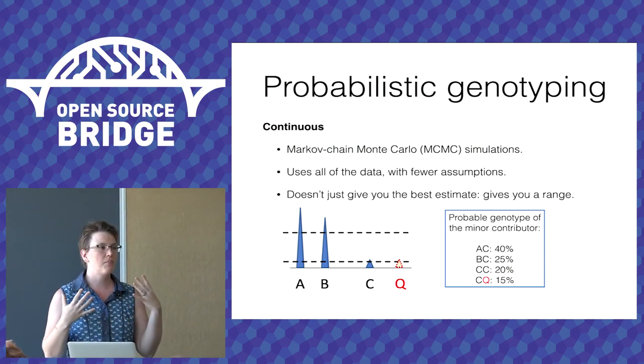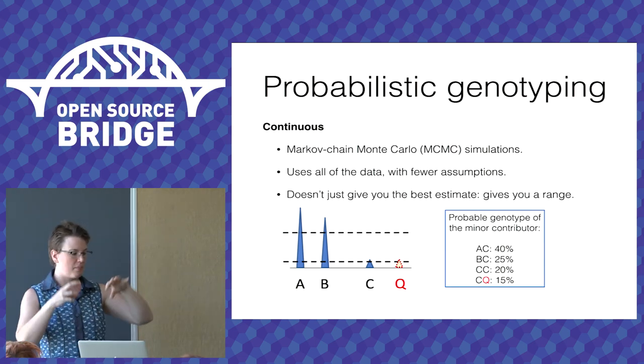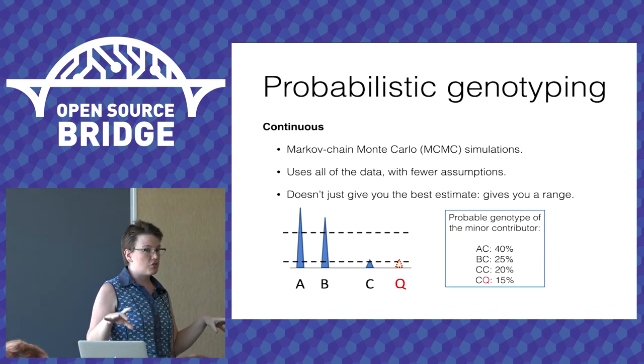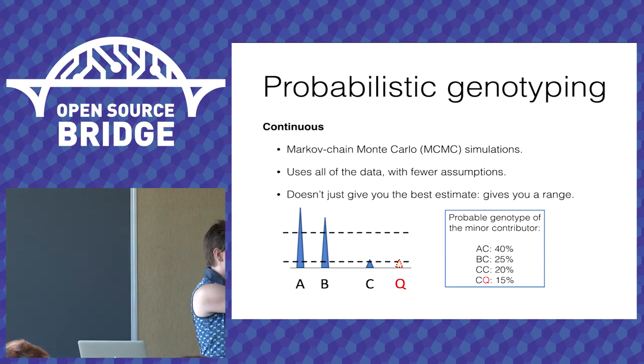You're predicting the probability that an event will occur based on information about the prior state of the event. So we know how frequently those DNA alleles occur in the population. So what is the chance that I'd end up with a mixture that looks like the mixture I got from the evidence?